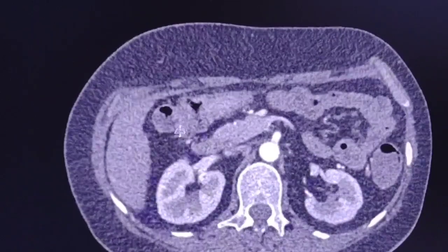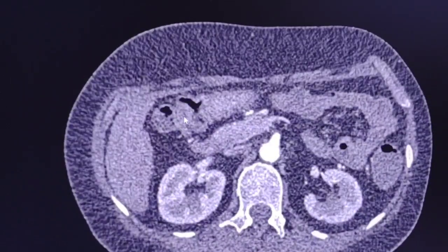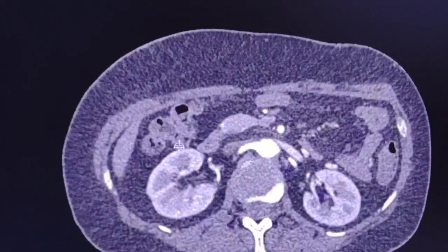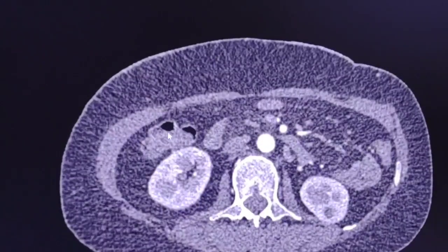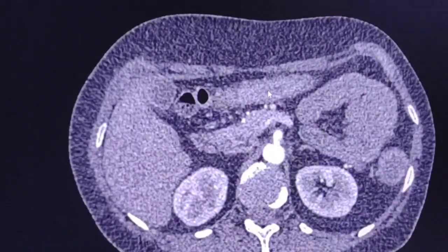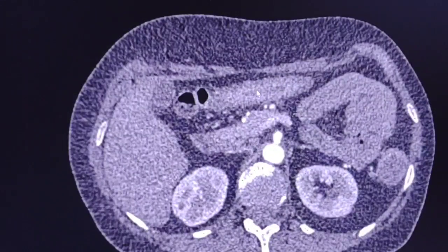At this point, the right colonic curvature looks almost normal here. So you can see the difference from the normal to the pathological. The inflammatory changes.